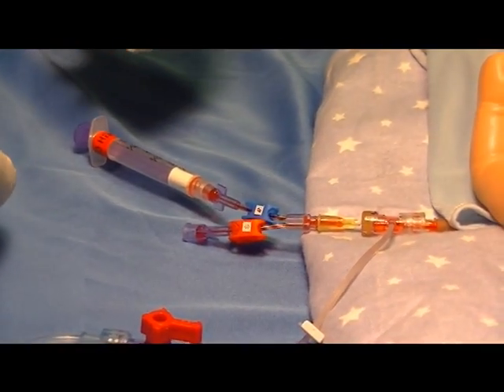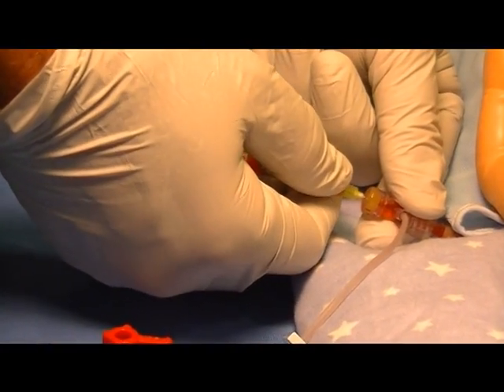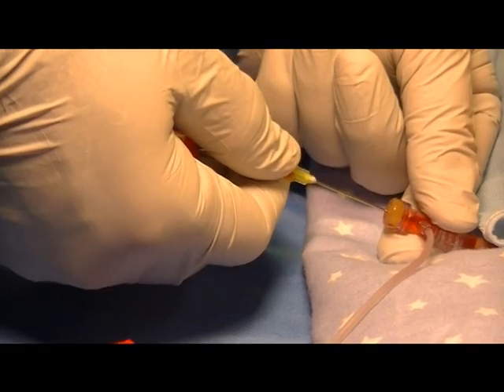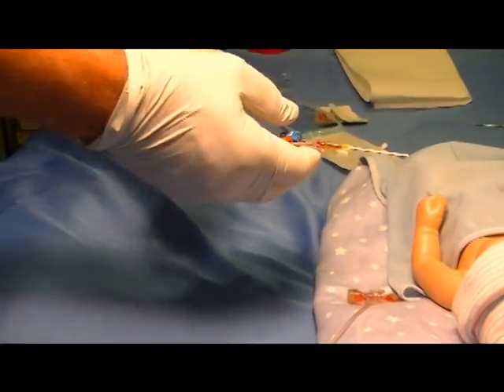Remove the Humi from the T-connector by pulling it out slowly, then dispose of the Humi and the waste syringe in the appropriate sharps container.